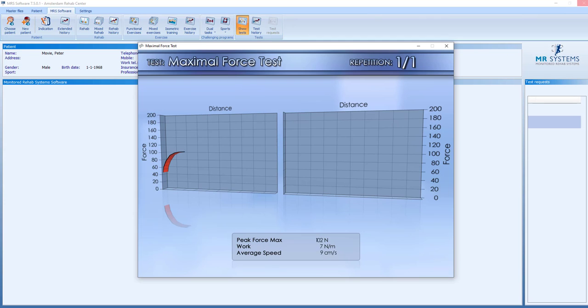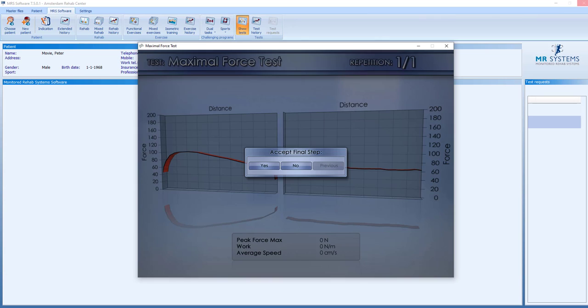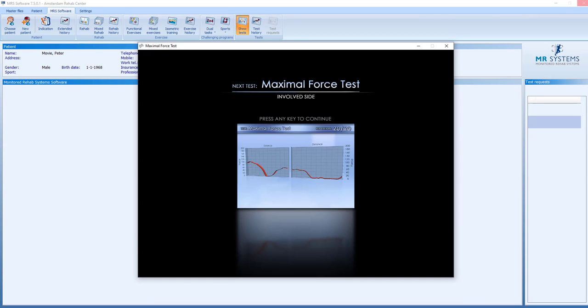And we ask one repetition, maximum speed, maximum force up and slowly down. We can accept this or we can say no. Maybe you can perform better and you also see previous. If you say you can do better but you will not manage, you can save the previous performed test.